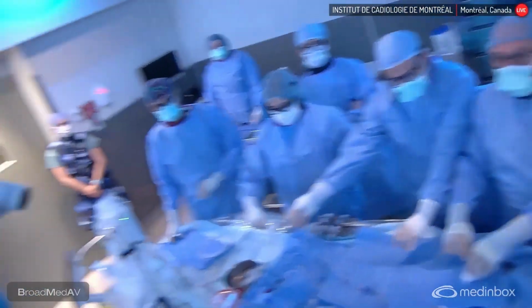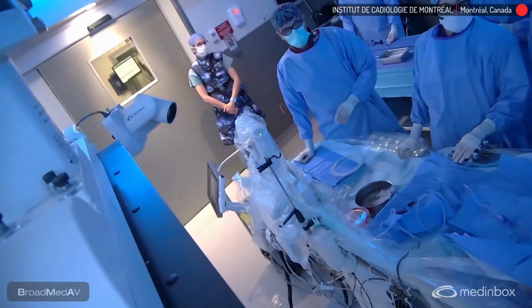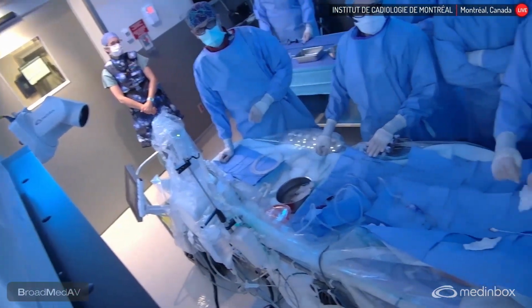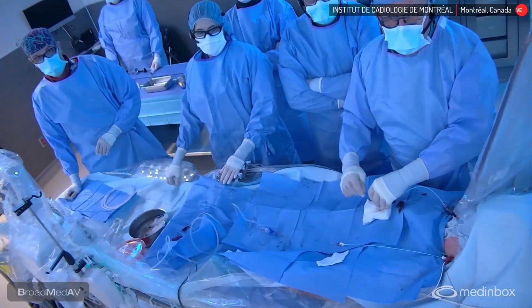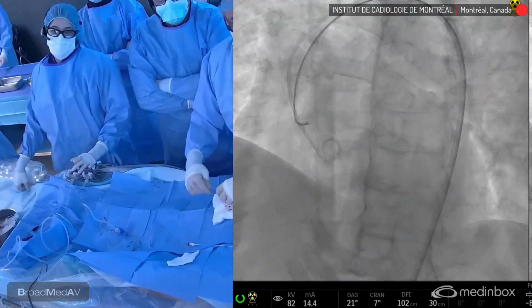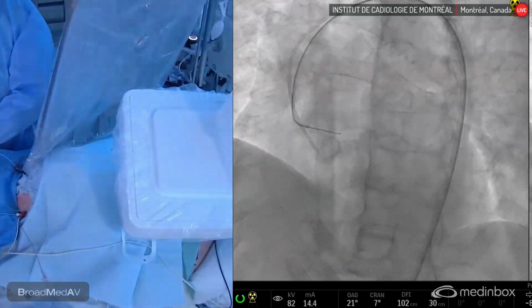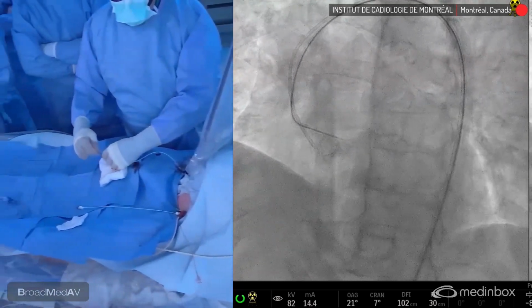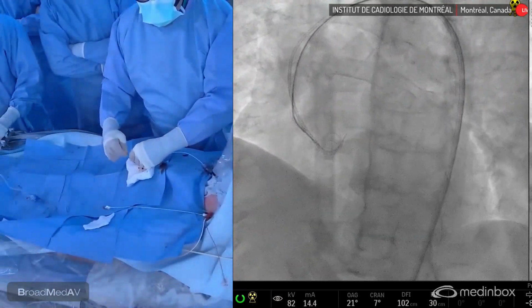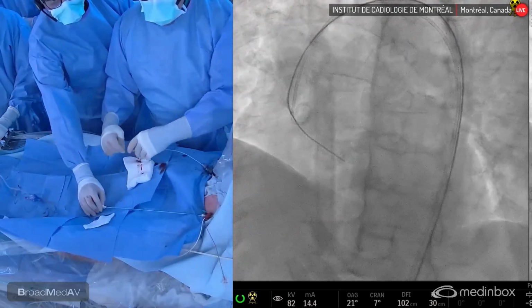We've got a 5 French AL1 catheter in place. And Raul's going to try. Oh, sorry. No, it looks like a JR. We don't have it. So we're back ordered on the AL1. We have a JR. And we're in our 3-cusp view. So I think obviously for Evolut, there's a fashion to do more in the 2-cusp. But for an Edwards, we're happy in the 3-cusp. I don't think there's any need to move the image intensifier.